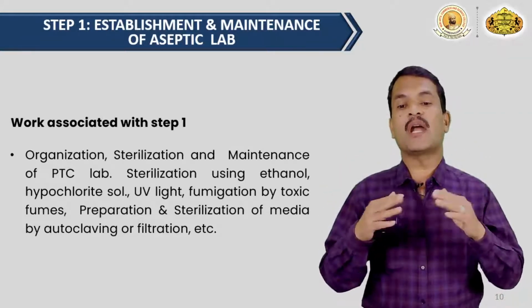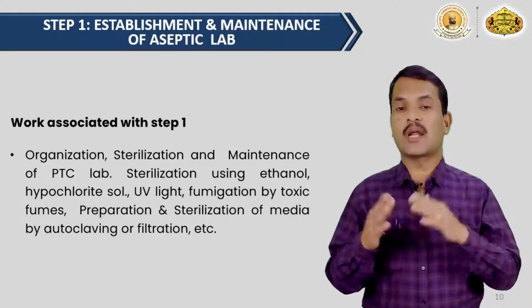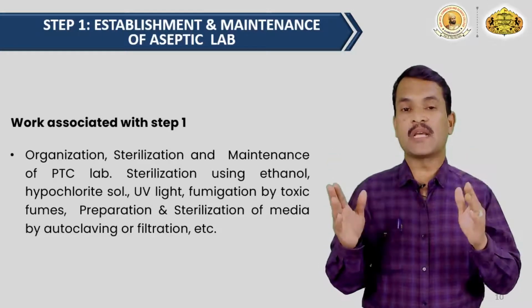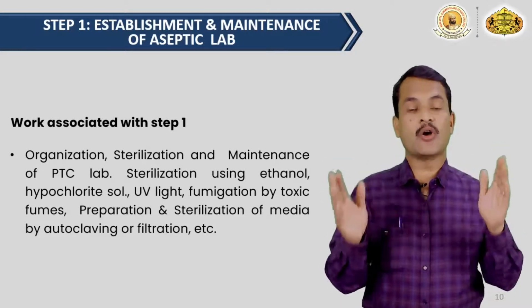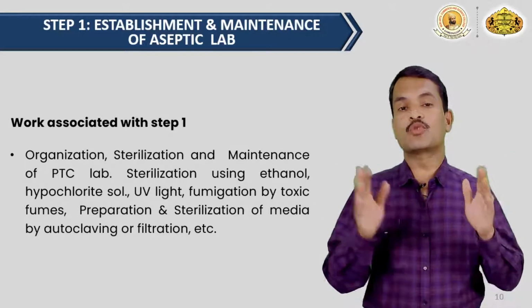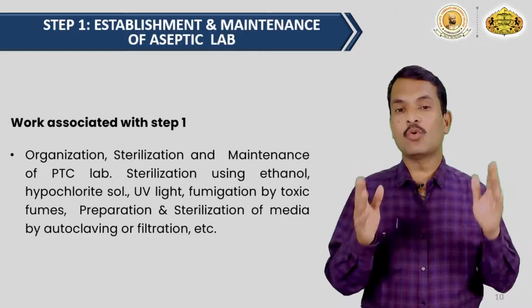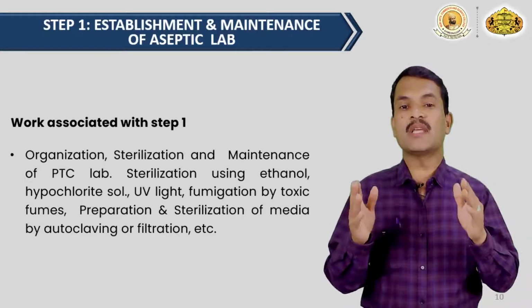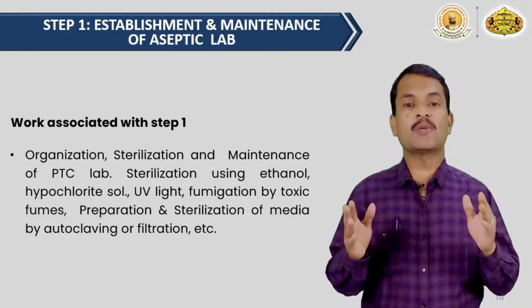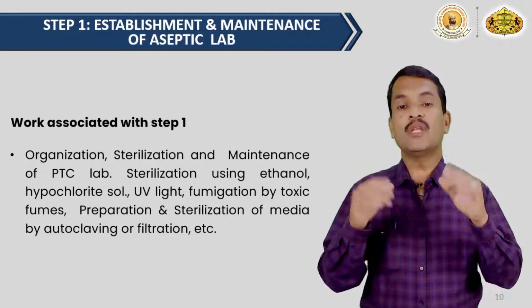In addition to that, you may do the fumigation of all the 3 labs. There are 3 labs, as I told you in the previous lecture: the general lab, the inoculation room, or aseptic transfer area, and the culture room. All these rooms, at least the last two rooms, the aseptic manipulation area or inoculation room and the culture room, must be free from any kind of microorganisms. So as per that need, we need to take care.